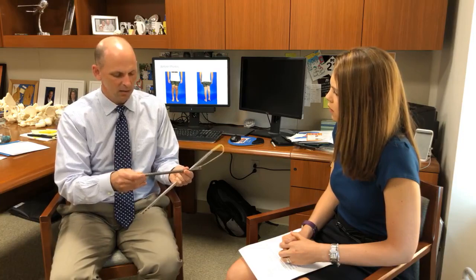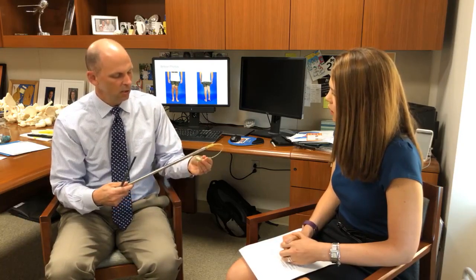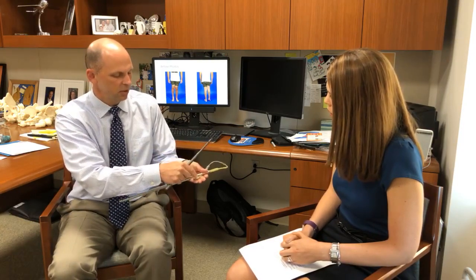Now in this case, with this type of rod, there's a magnet inside the rod so that when it's inside the bone, you put a magnet on the skin and it slowly lengthens the rod. And you do it a little bit several times a day and lengthen the rod, so it uses a magnet. Where this type of rod uses a little transducer, and you have a little box that sends a little current to the transducer, and the transducer causes it to lengthen. It's just a different type of rod, and there's certainly indications for both, and that's what we discuss obviously when we work with patients, is what's going to be the best technique.